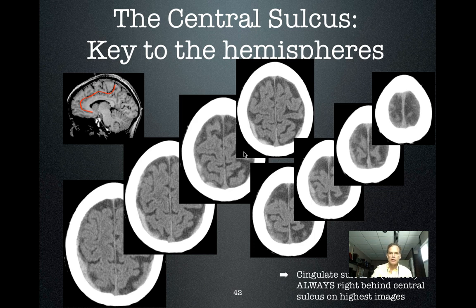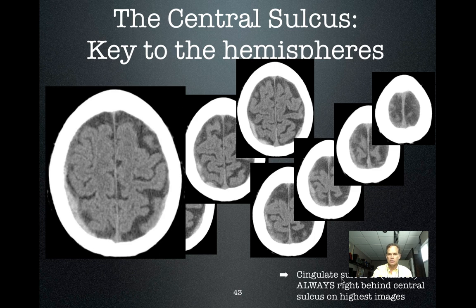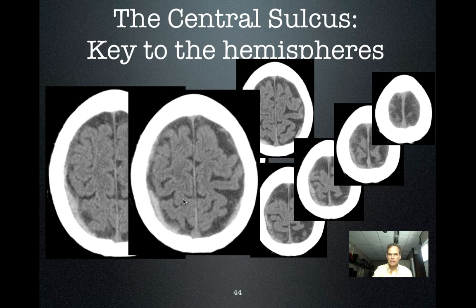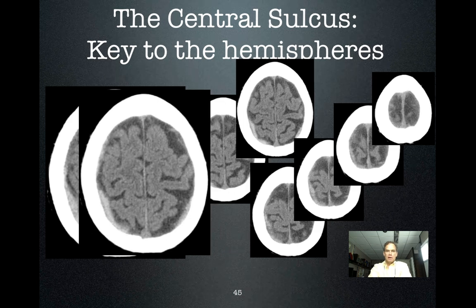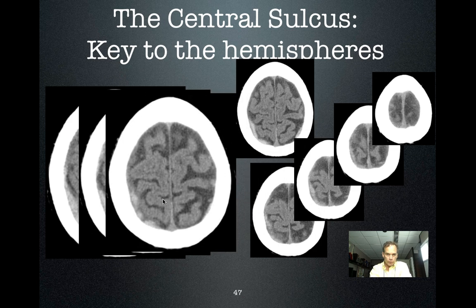How do we find the central sulcus? Here is the key: the cingulate sulcus is a relatively identifiable structure — you see it right here. That is the key, because if you can identify this, then you go forward and to the side, and there's the central sulcus. Notice there are several things kind of like that, but none have that somewhat elongated and curled kind of appearance. This is the cingulate sulcus — c-i-n-g-u-l-a-t-e. You see that, and then you go forward and over — central sulcus.